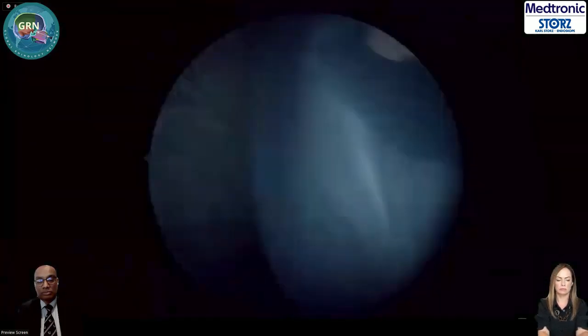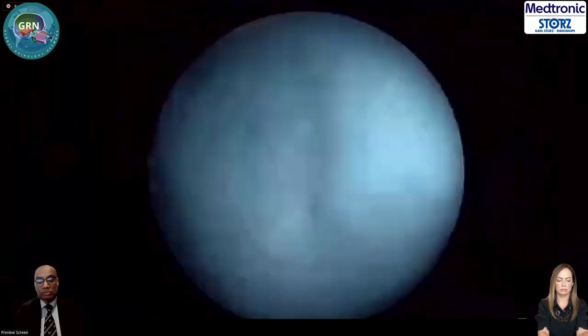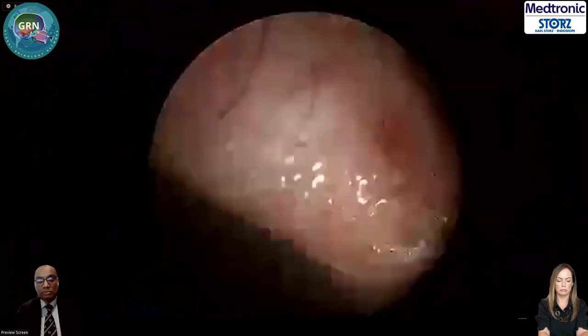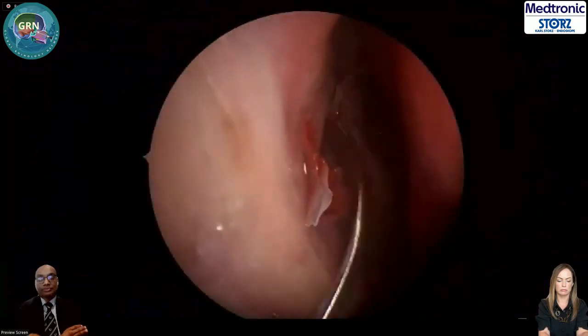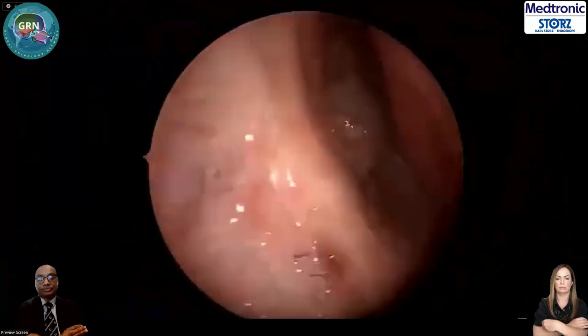Okay. Now we want to check again inside the maxillary sinus.